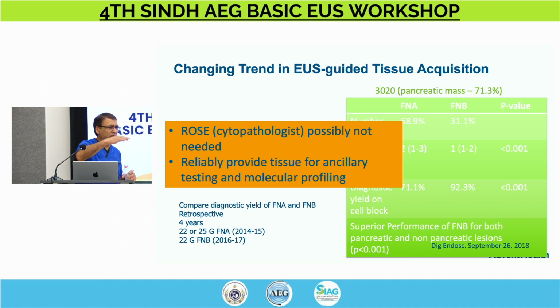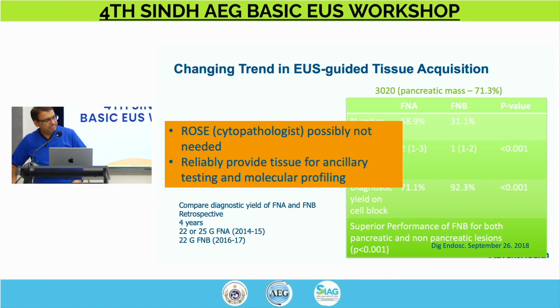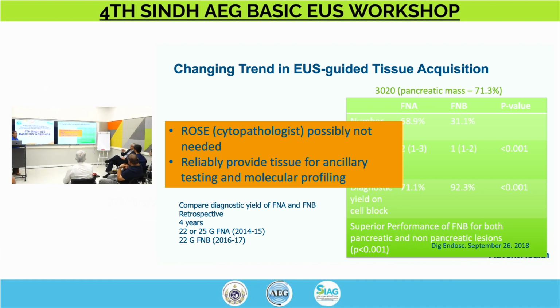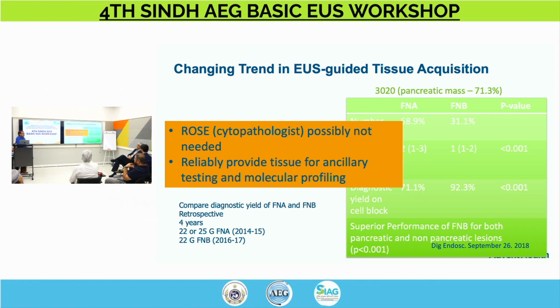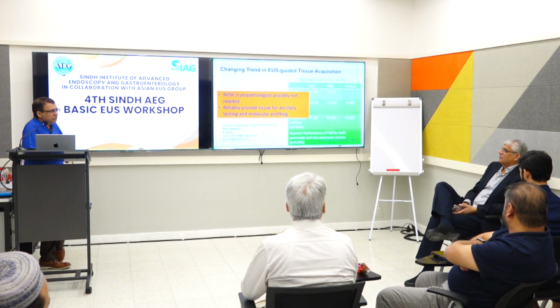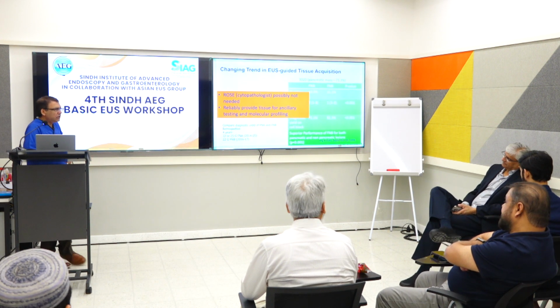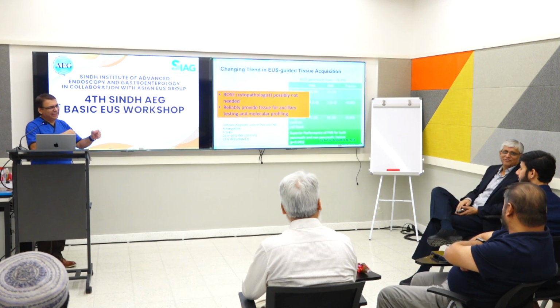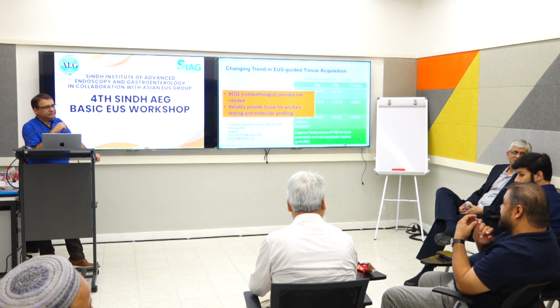I was also asking how many people have, in your experience with FNB, when you're doing it, how many passes do you make? On average, when you go in, the first pass, how many times do you do it in one pass and how many times do you do more than one pass in FNB? So we also kind of discussed that.